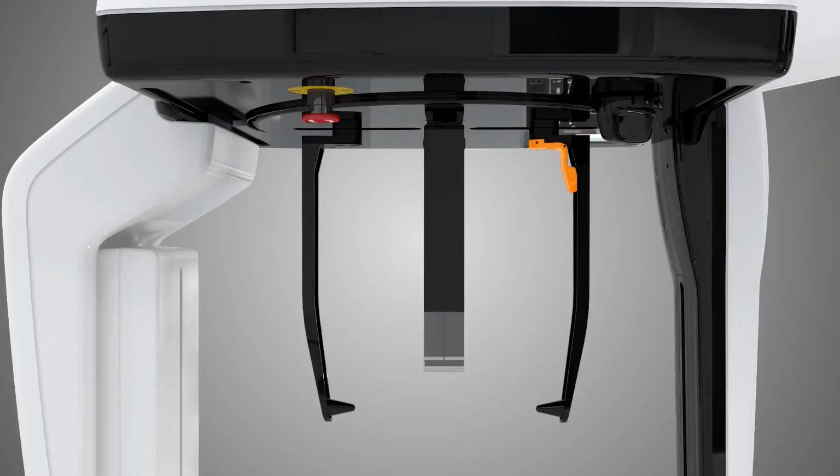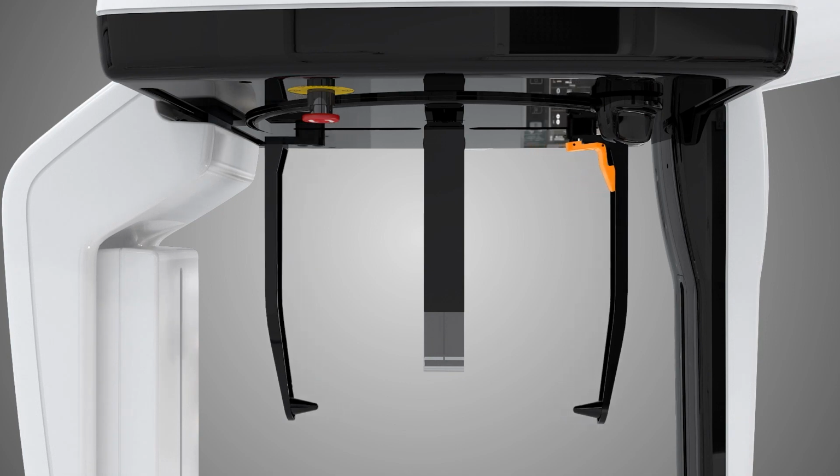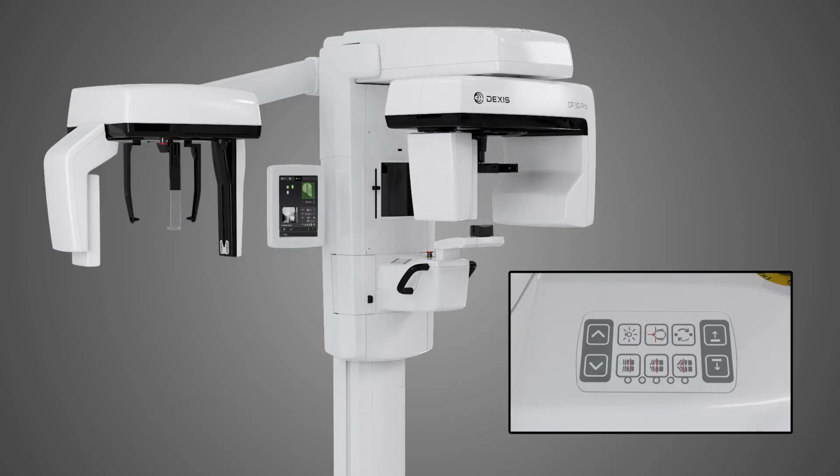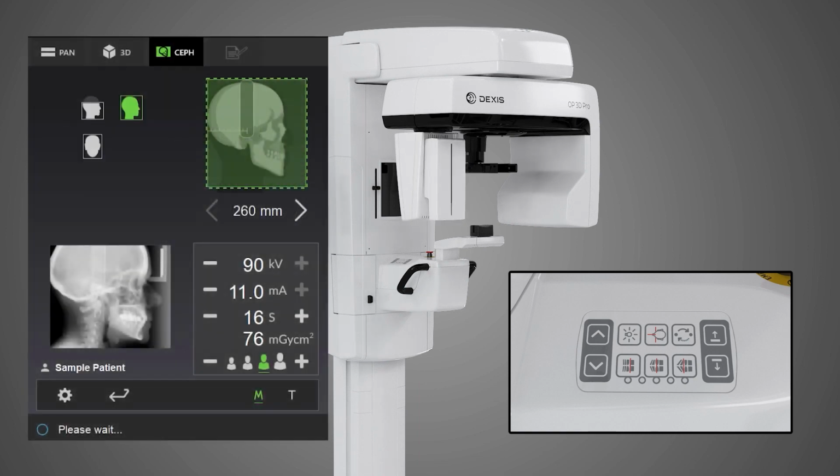Open the ear rods by pressing the ear rod brake button and sliding the ear rods into the outermost position. Press the Patient In button on the positioning panel. The unit is ready for the patient when the Ready indicator light on the touch panel turns green. Ready the patient for the procedure.